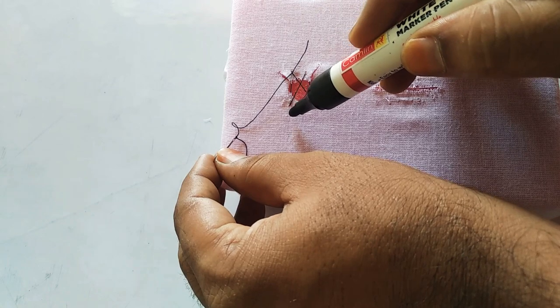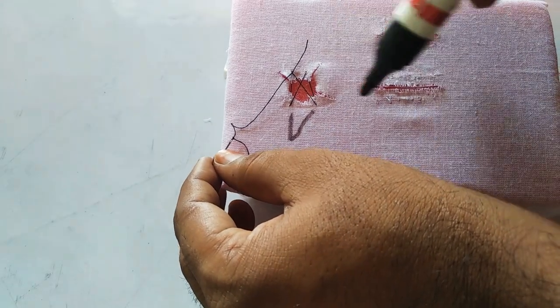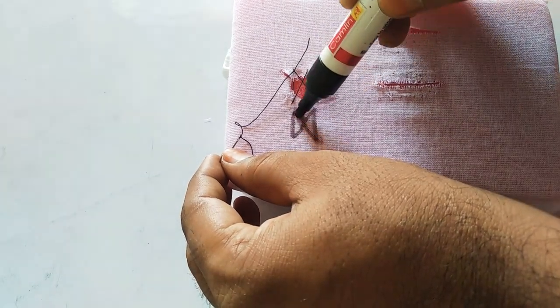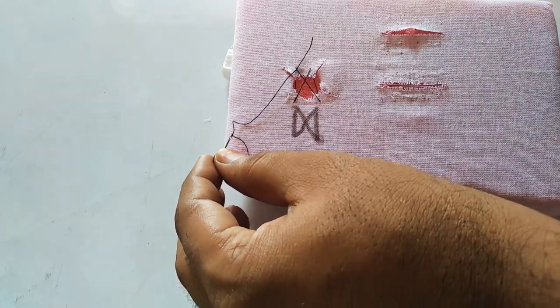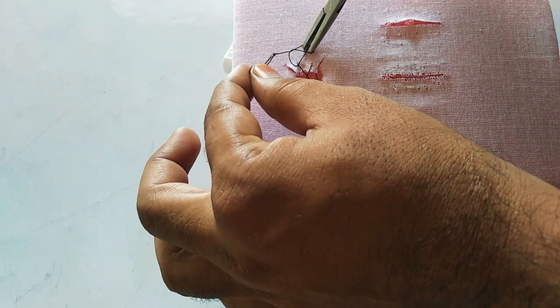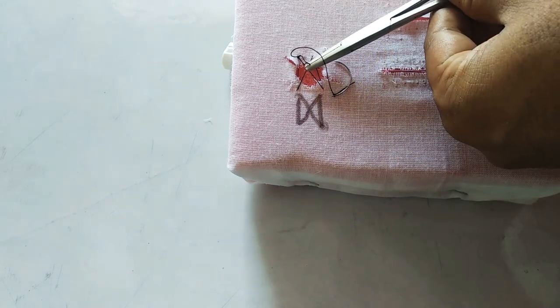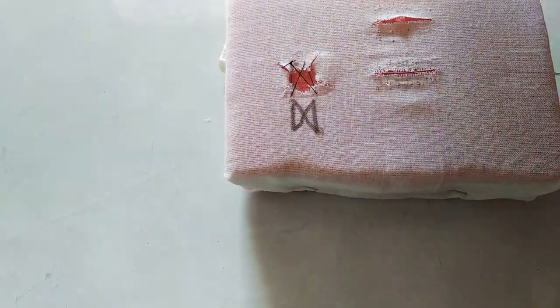First I went like this, then came back to the buccal side distal, then lingual side distal. The crossing between the lingual side distal and buccal side mesial completes the figure of 8 — that is exactly what has been done here. This is the figure-of-8 suturing technique. Complete the knot and then cut it.